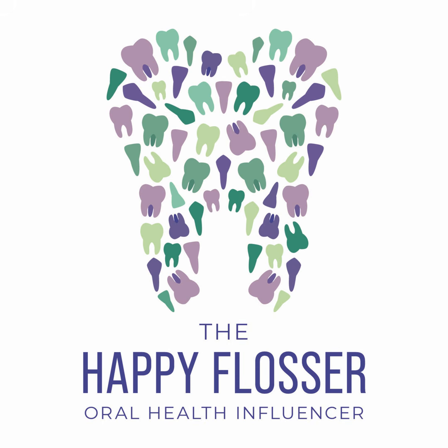Some of the outliers or things that you might notice as a dental provider is when you take a Panorex x-ray, don't look at just the teeth. You want to check out the TMJ, look at the sinuses, look at the neck. You may catch calcified lymph nodes in those soft tissue areas. You may notice calcification within the walls of those internal carotid arteries.